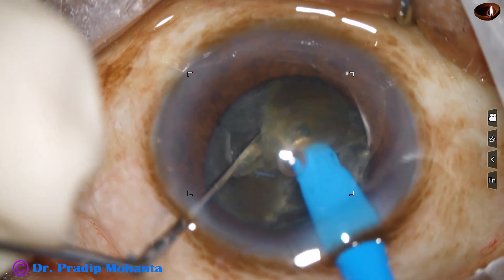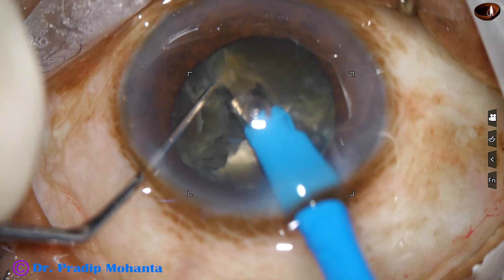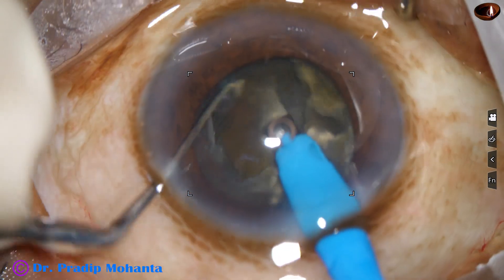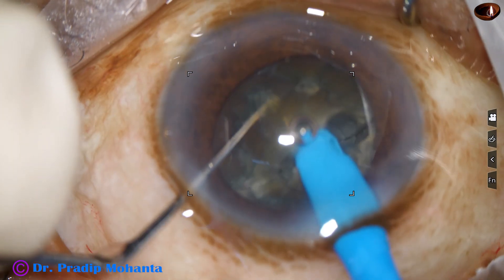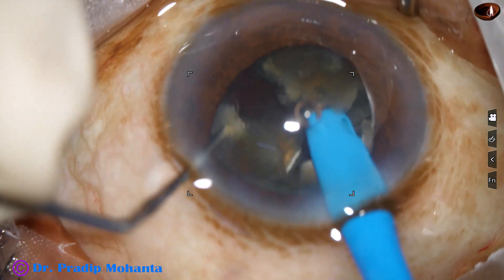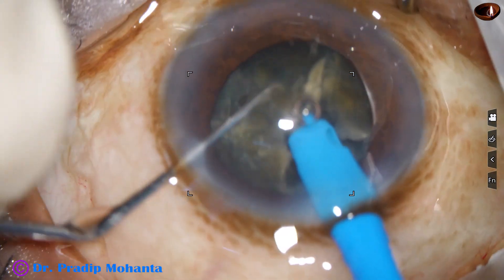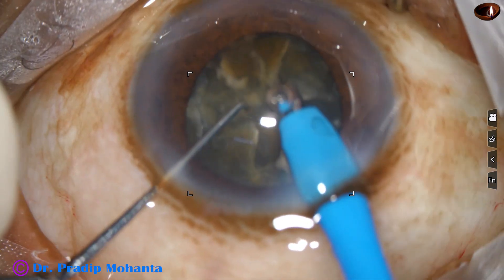The two hemi-nuclei are separated completely. This hemi-nucleus is chopped, but the two pieces are not free — they are joined at the center. I come to the other hemi-nucleus and try to chop it. The tip goes through the substance of the nucleus, and in this case we get two free pieces. One free piece is subdivided into two smaller pieces, and emulsification is carried out.